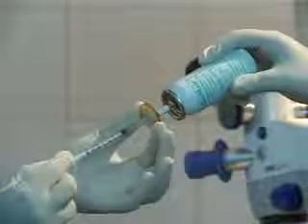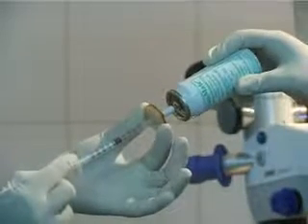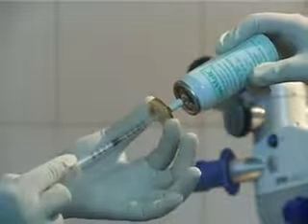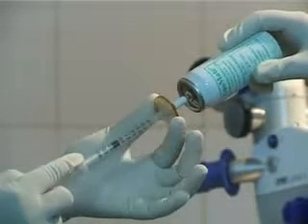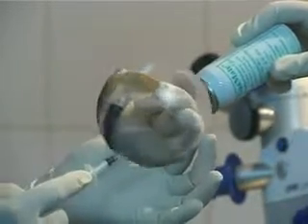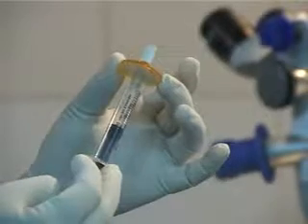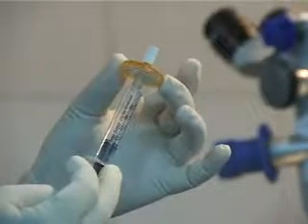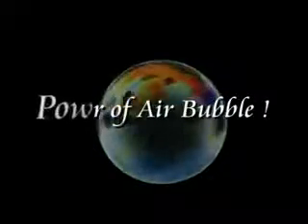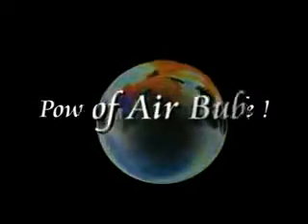Many surgeons use expansile gas like C3F8 in various Descemet membrane problems, but it is expensive, risky, and needs supine positioning of the patient for a long time. Instead, we can use air in these cases. This video is all about the power of air bubble.